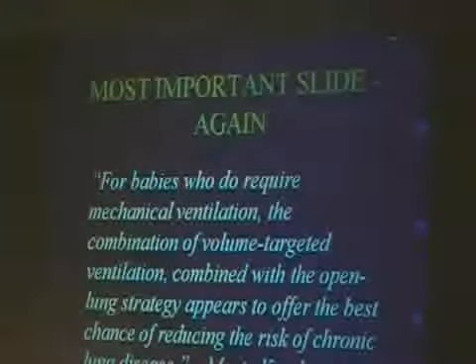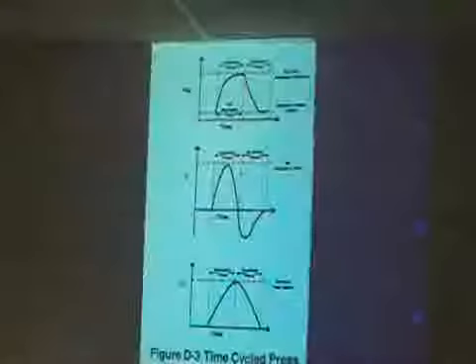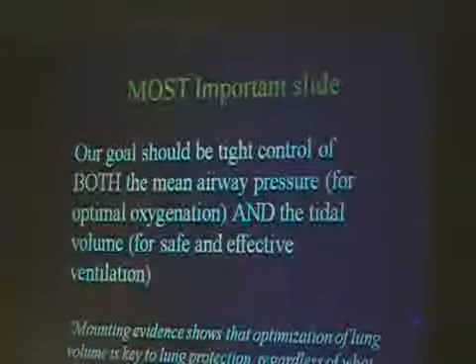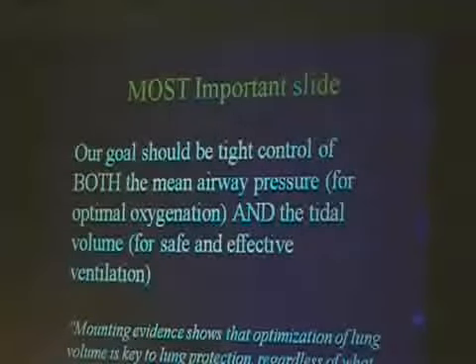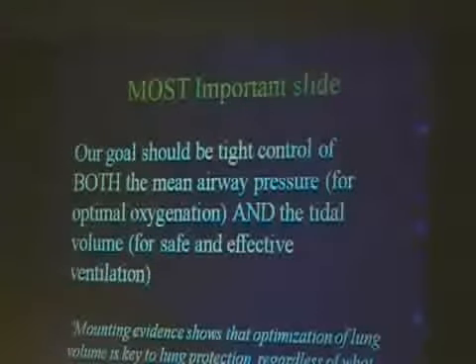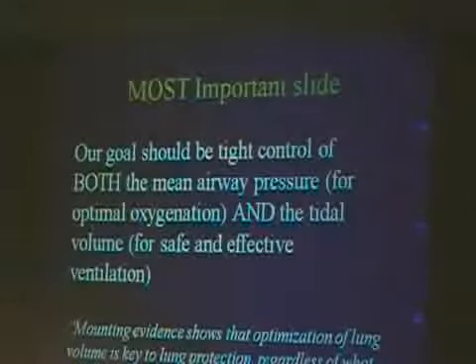Could you just go back to the previous most important slide? I think I was just getting understanding that. Oh wait, this one. Check both mean airway pressure and tidal volume. We'll come back to these things again and again. It's the crux of any form of ventilation, including CPAP.